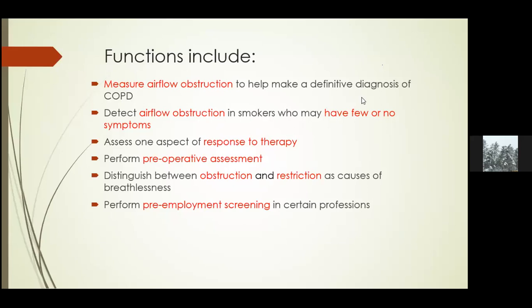Now, in some cases, before you are allowed to go for an operation or surgery, they have to do some spirometry so that they can check whether you are in a fit condition to be allowed to go for that. So it is used as a pre-operative assessment test. Then you can also use spirometry to distinguish between obstructive disease and restrictive disease, just like I mentioned in the previous slide.